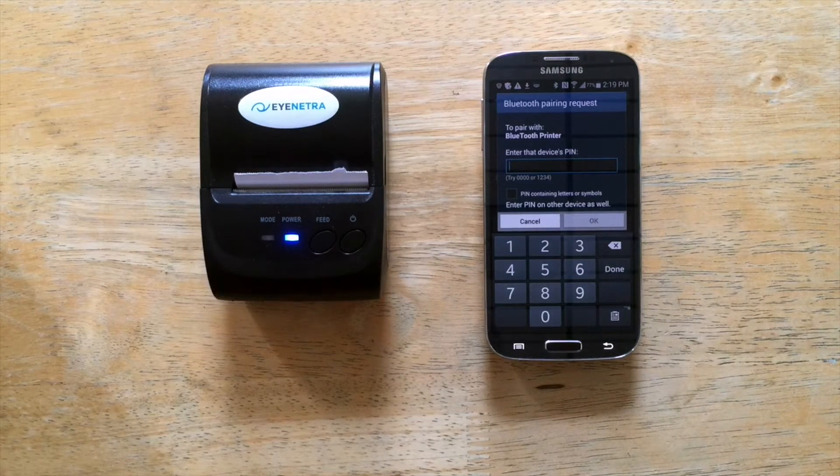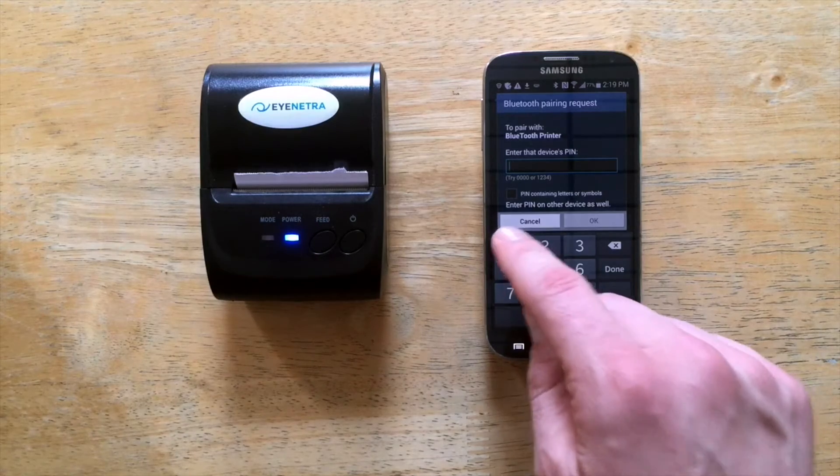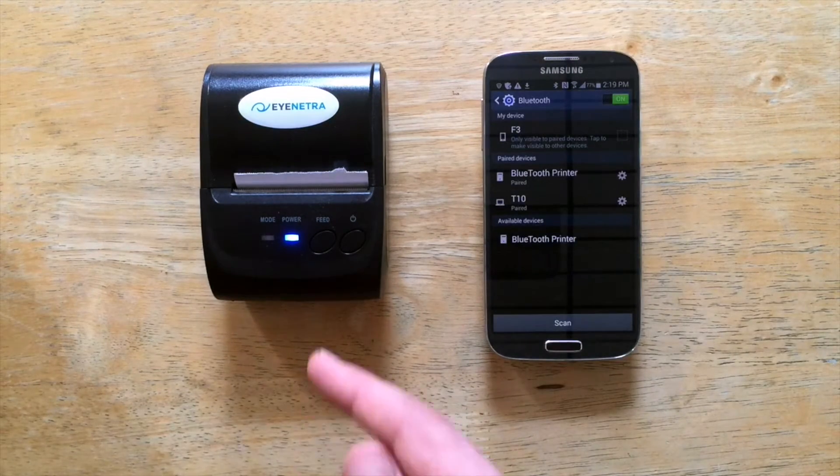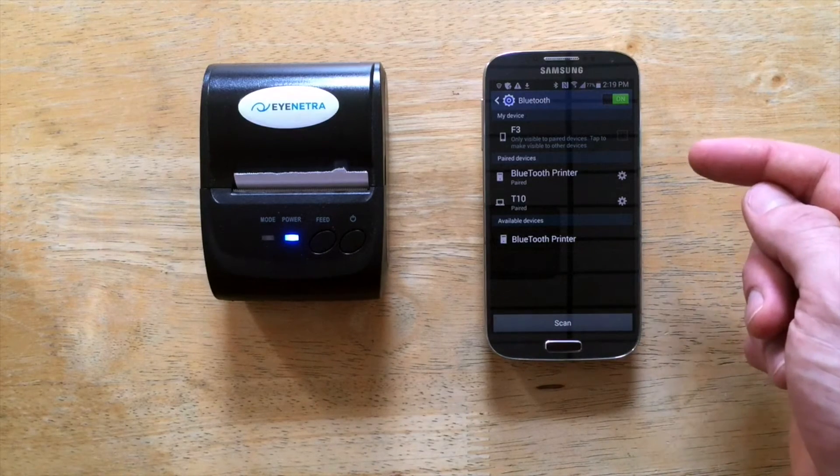It's going to ask me for a device PIN. Your PIN will be either 0000 or 1234. My printer is now paired to my iNetra phone.